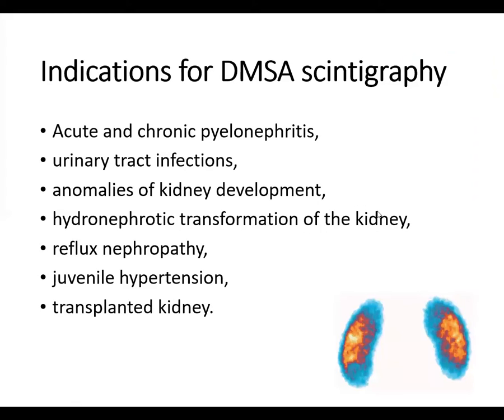Indications for the DMSA scintigraphy are acute and chronic pyelonephritis, urinary tract infections, anomalies of kidney development, hydronephrotic transformation of the kidney, reflux nephropathy, juvenile hypertension, and transplanted kidney.